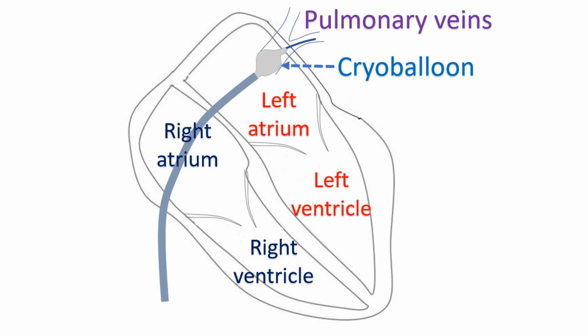As the cryoballoon produces uniform cooling around the opening of the pulmonary vein, the chance for missing a region of abnormal electrical activity is less. Moreover, it is more convenient as multiple ablations using a conventional cryoprobe are not needed.